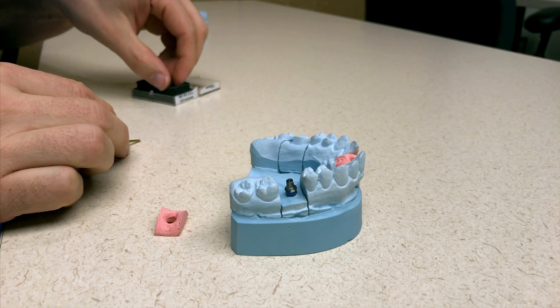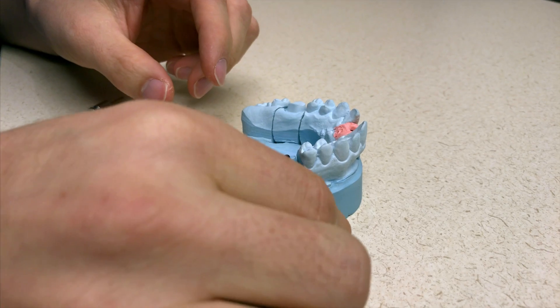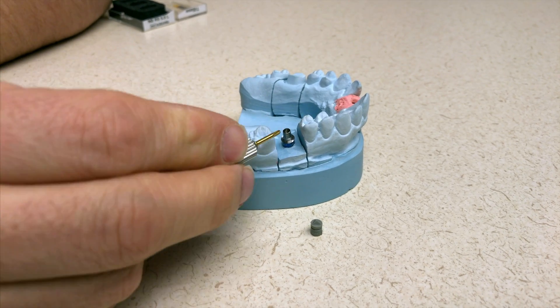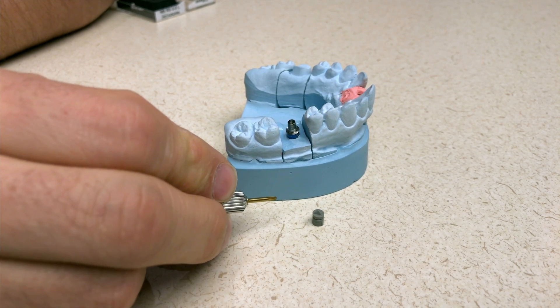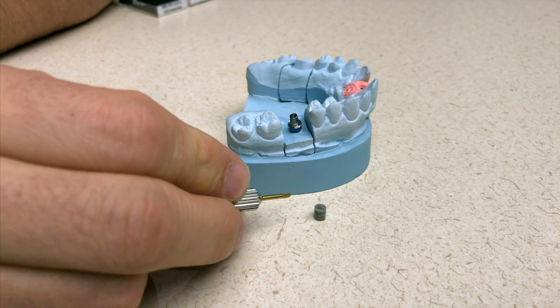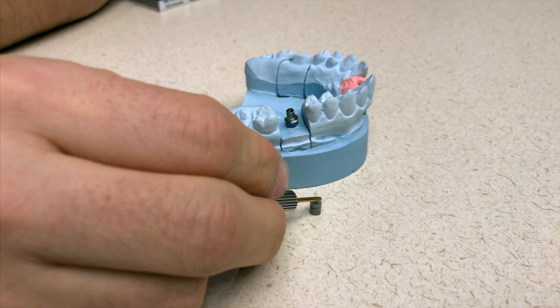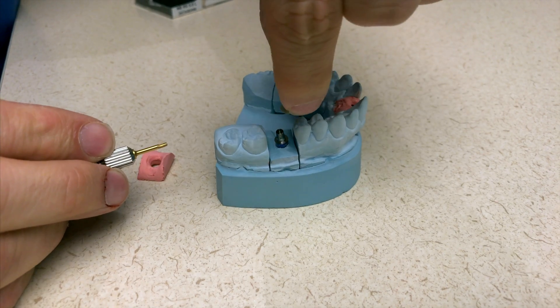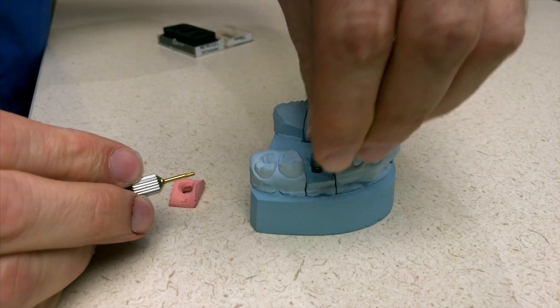Now that it's seated, we're going ahead and get the scan body. For the Omnicam, it's gray — you can use the white one too, I haven't had a problem with it. It's a little cap that's going to slide on top of the tie base. Notice there's a triangle — it's an isosceles triangle. The two long sides point to the little positive outcrop. I'm going to take that little outcrop and marry it up with the tie base that I put on, and it's going to snap down right on there.